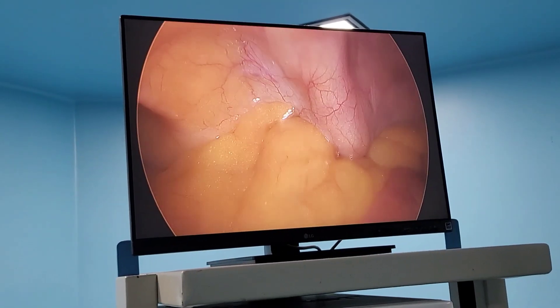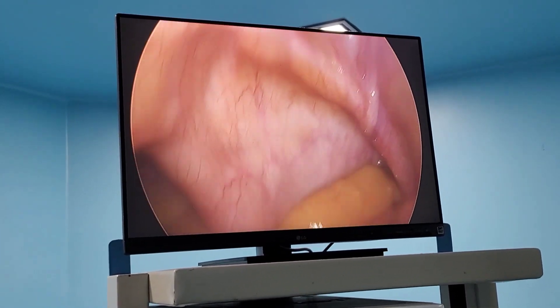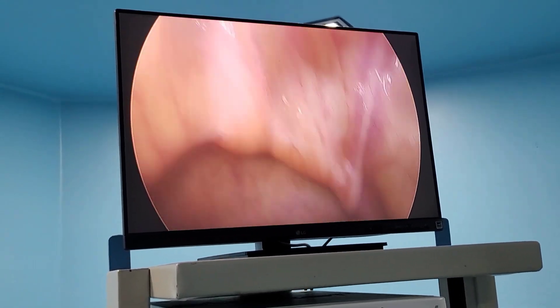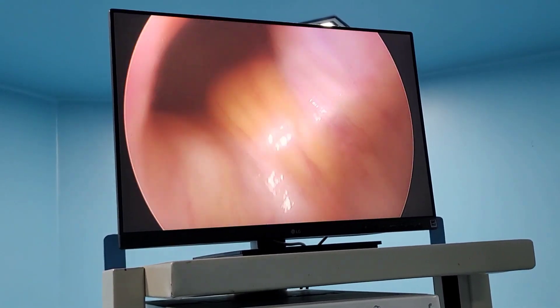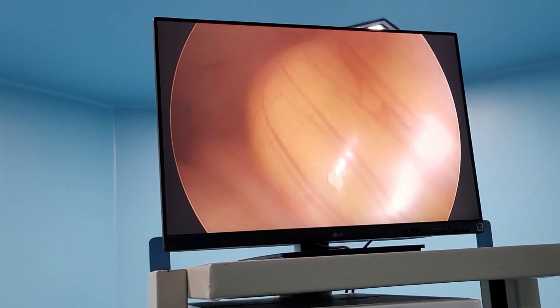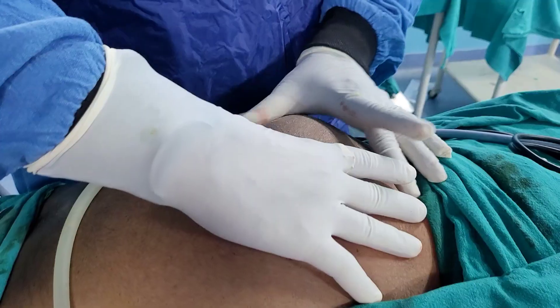One very important thing: where is the bladder? You have to feel that. This is the bladder, this is the medial — or lateral pillar of the bladder — and this is the fold of inferior epigastric. So this is the fold of inferior epigastric. And where is the hernia? This is the hernia. Let us go inside the sac — you can see it's a large direct hernia. Let us start with the surgery.